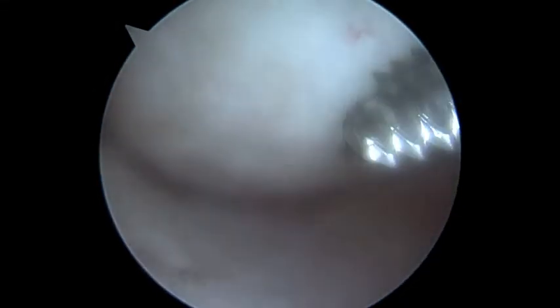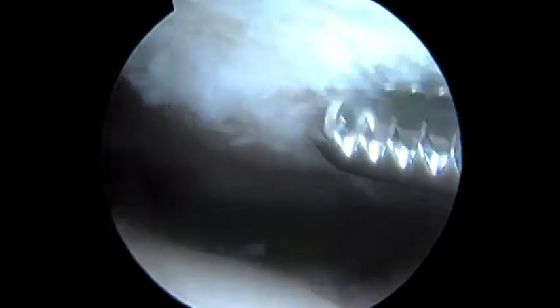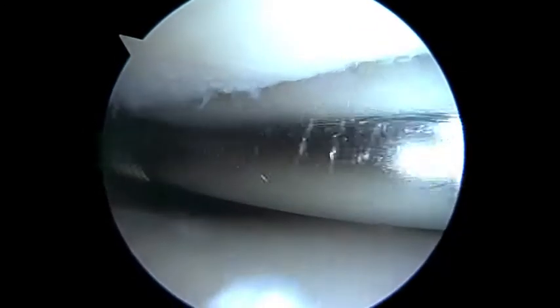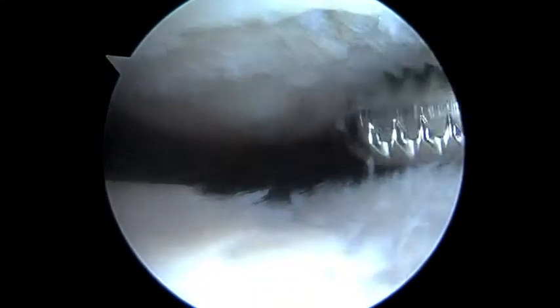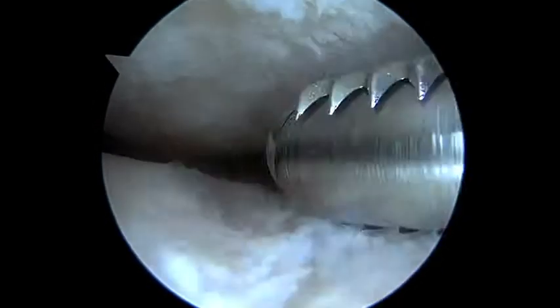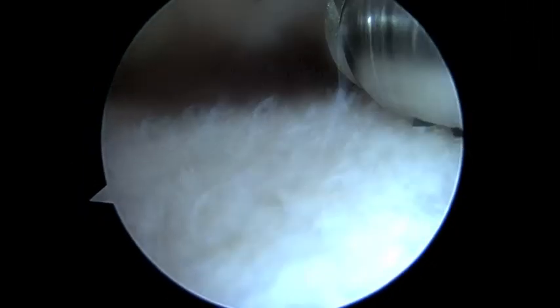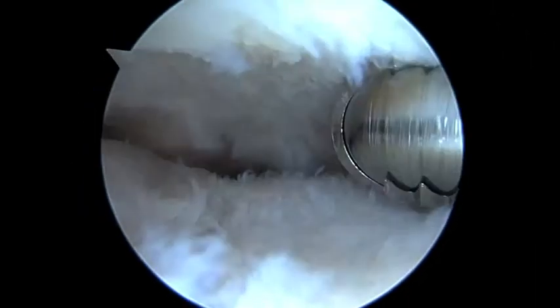Hopefully we've got a good healing response now that we've stimulated the area. Here we're looking up at the patella, and we're smoothing this out too. We're looking from the medial portal — that's how you view it, maybe a little bit different.